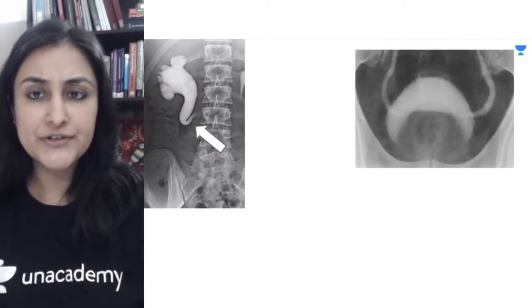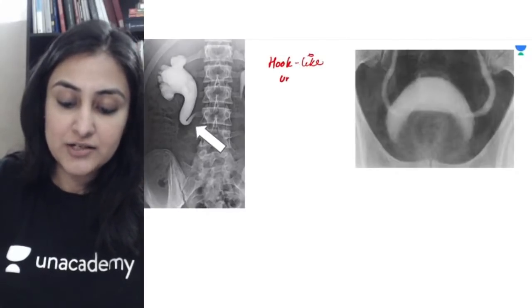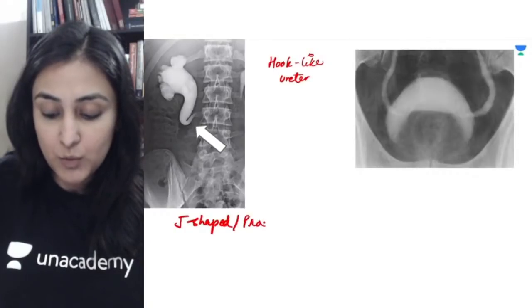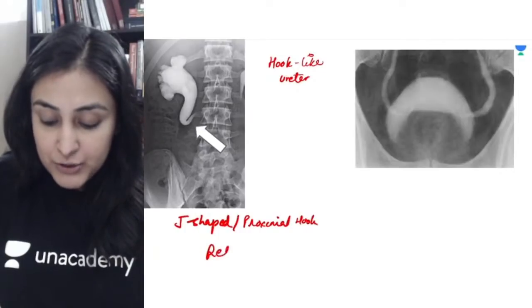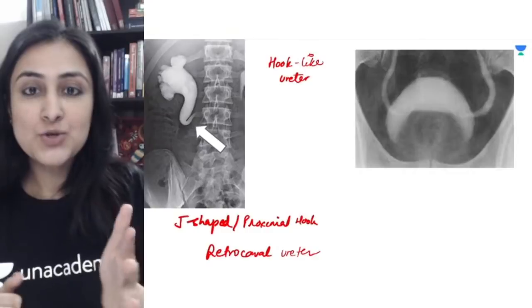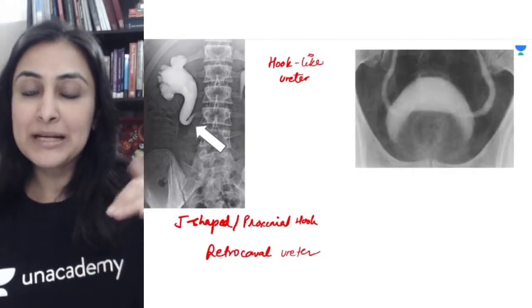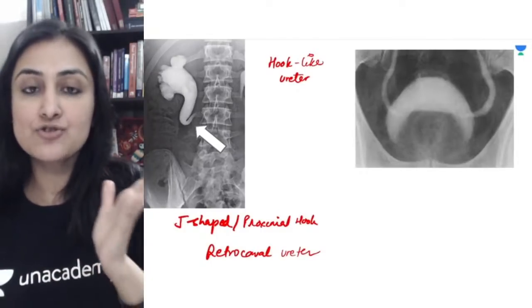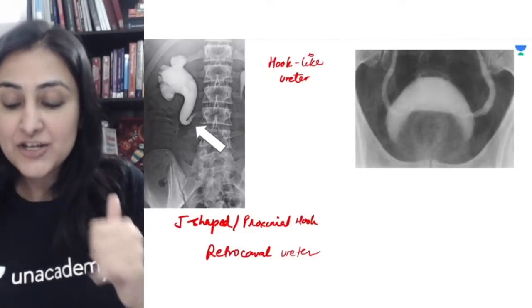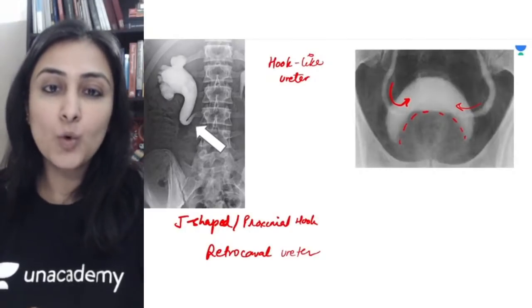Two same appearances but different diseases — same sign. Both have a hook-like ureter but completely different conditions. When you have a proximal hook or J-shaped ureter — described as a proximal hook — this is a retrocaval ureter. The IVC is not formed properly, so the ureter has to go behind it and gets obstructed. This is your proximal hook-like ureter.